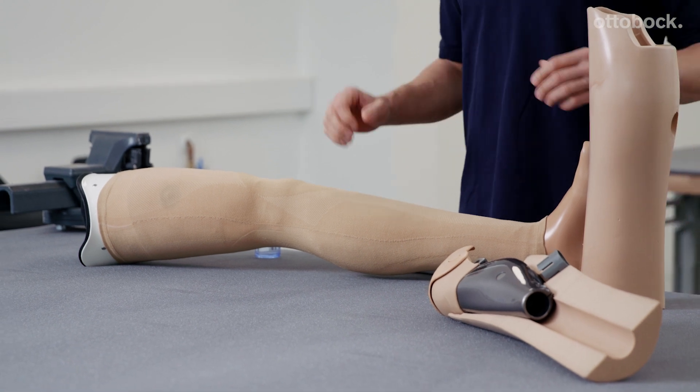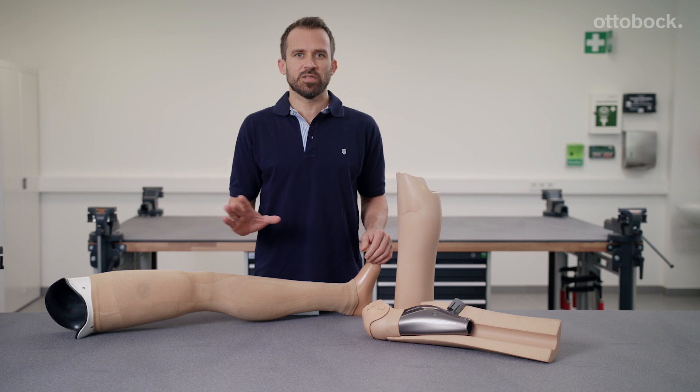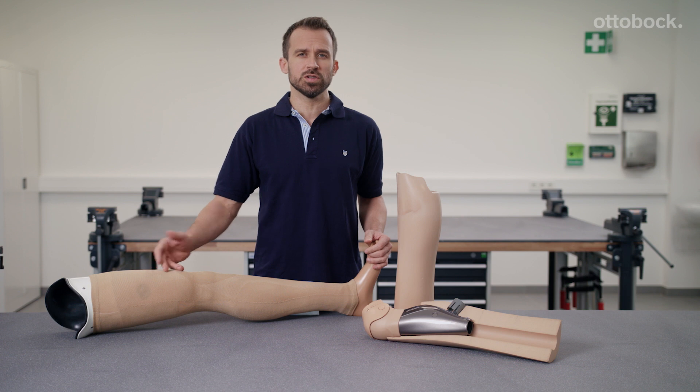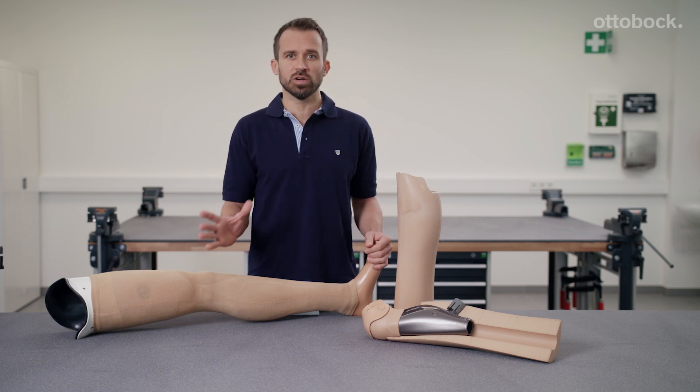The functional knee part and shank are ultimately both enclosed by an elastic, functional and washable stocking. This results in an even low profile surface which protects the prosthesis against spray water and dirt particles, for example.